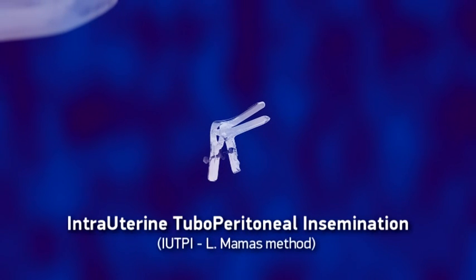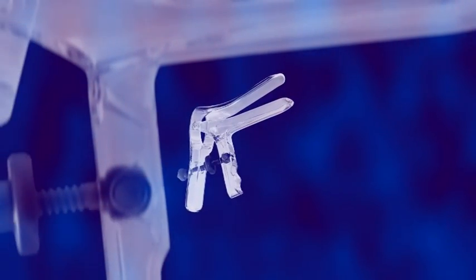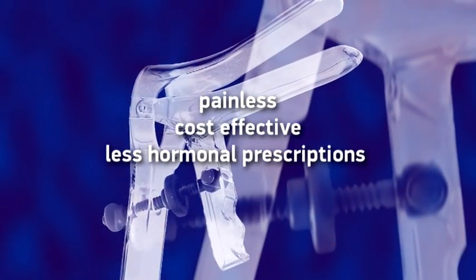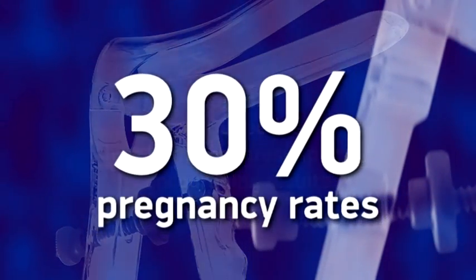Intrauterine tuboperitoneal insemination, IUTPI, Elmamas method, supported by the DNB cervical clamp, is an innovative insemination method — painless, cost-effective, requiring less hormonal prescriptions and very encouraging results, reaching 30% per attempt.